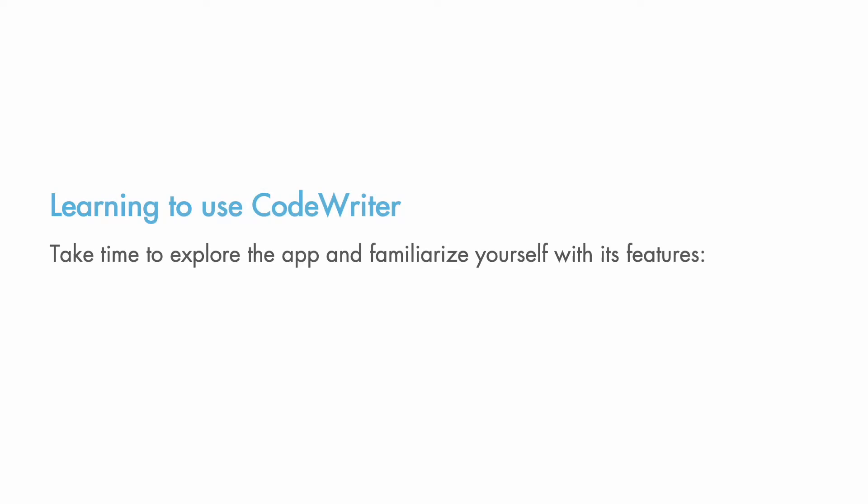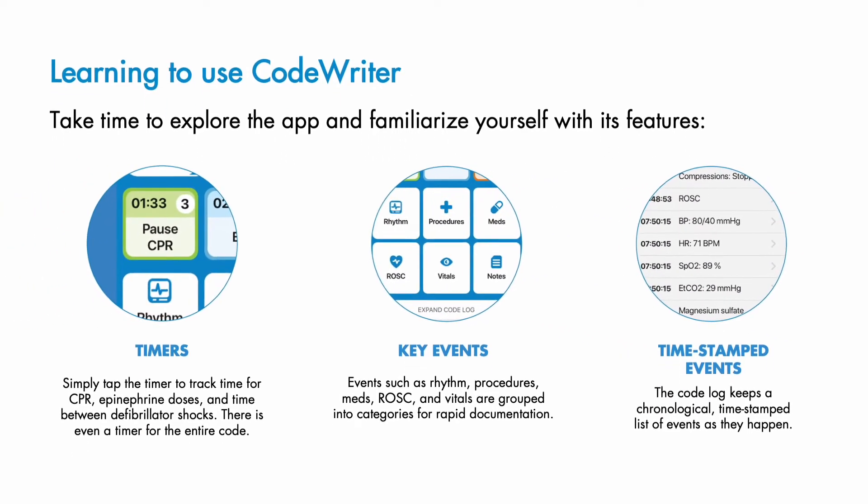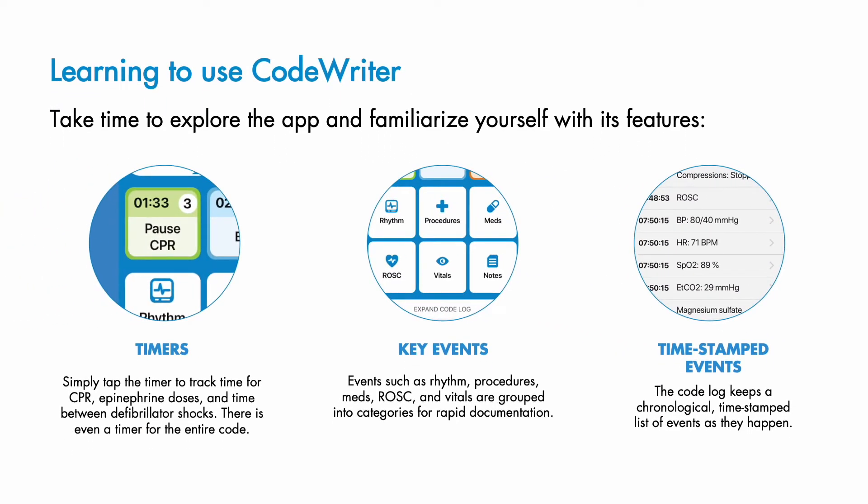Initiate a practice code and explore all of CodeWriter's features. Notice the timer buttons on the top row and review all key events you can record, such as rhythm, procedures, meds, ROSC, and vital signs. Refer to your code log as you interact with different features.